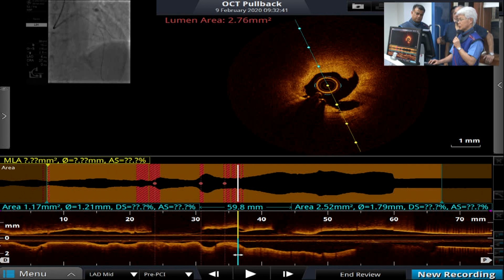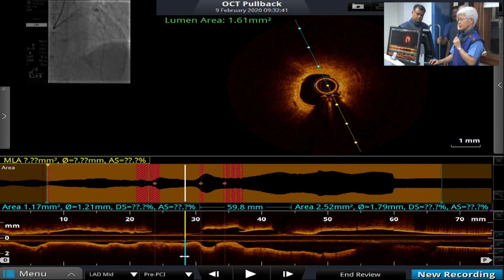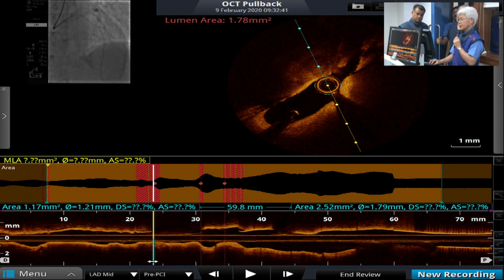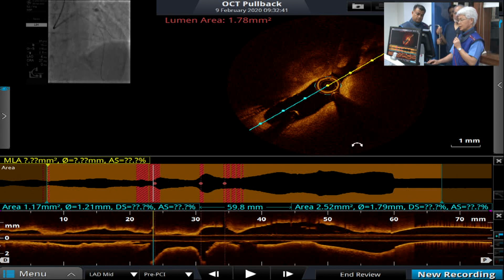You can see the two wires, right? Here, and still two wires, right? And here one wire goes away. Here is the diagonal, right? And there's no disease whatsoever there, right? So we try to check here. Here is the diagonal. You can understand, right?